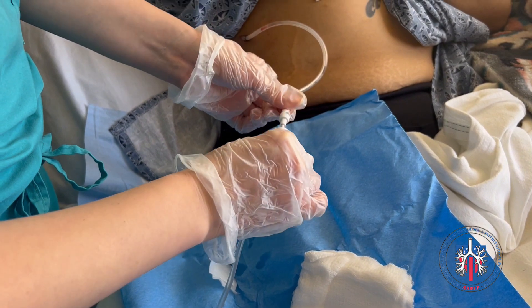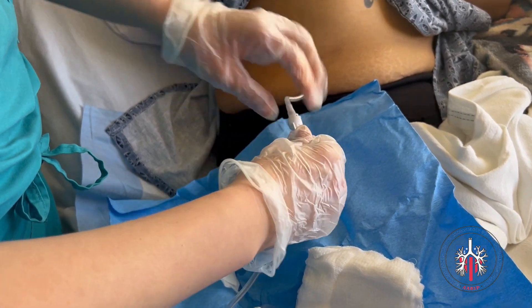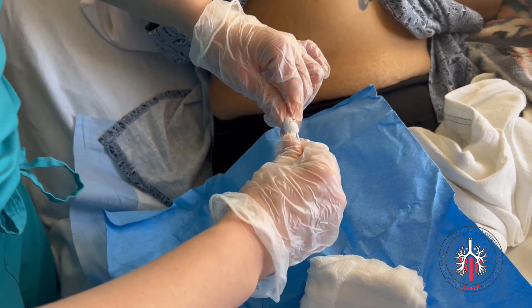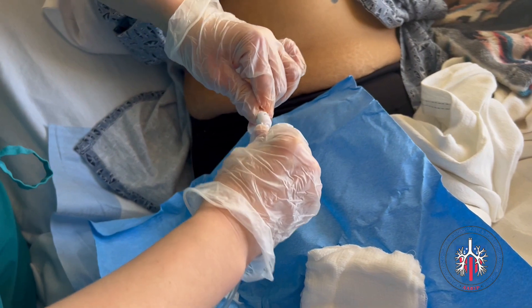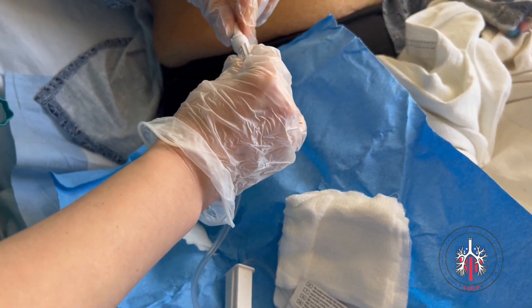The access tip of the drainage line is then inserted into the pleural catheter, and then with a twisting motion, the drainage line is locked into position. A click should be heard.